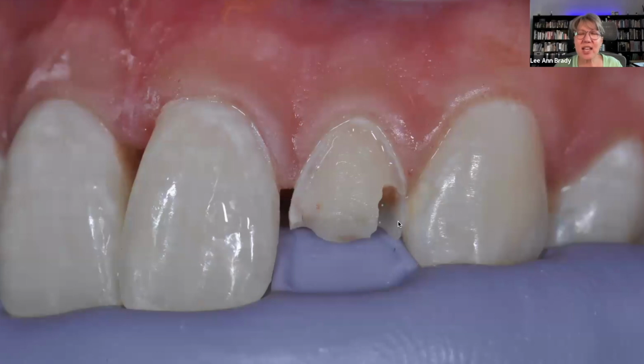But if I just did it at the fracture line, it'd be sort of like trying to line up striped wallpaper, and it's really difficult to do. So I want to be able to carry that from side to side myself. So the complexity of her enamel is what prompted me to do more preparation than I would need to do normally to do a composite like this. We're turning it into a composite veneer.